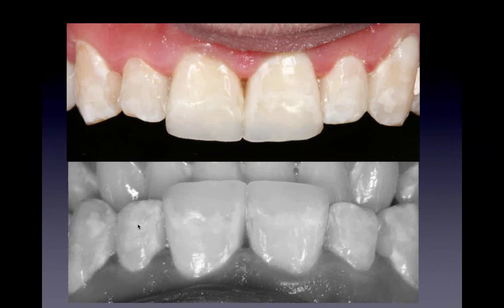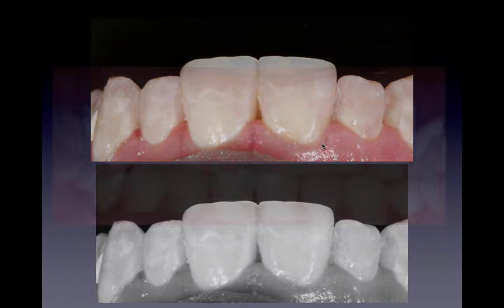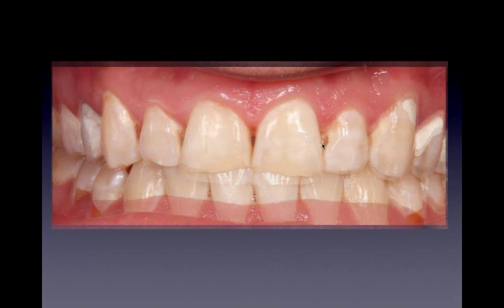Here's a black and white for the texture, and you can see it's all kind of matching. It's a little bit too translucent here, I would say, but overall a pretty good result for that kind of tooth. So that's his before, and that's his after. We've increased it about 1 millimeter to 2 millimeters.